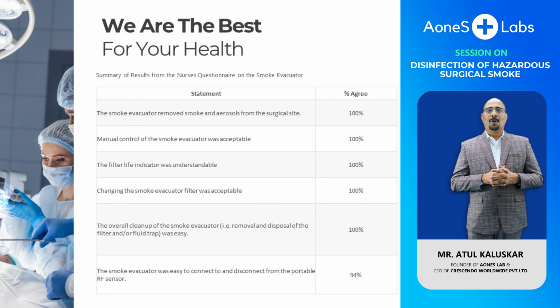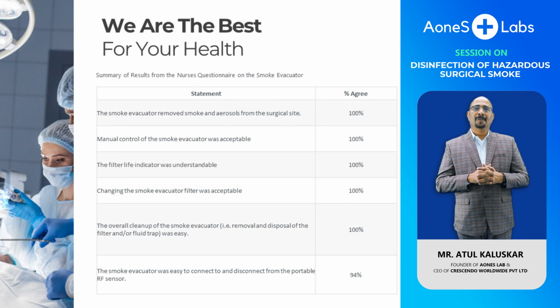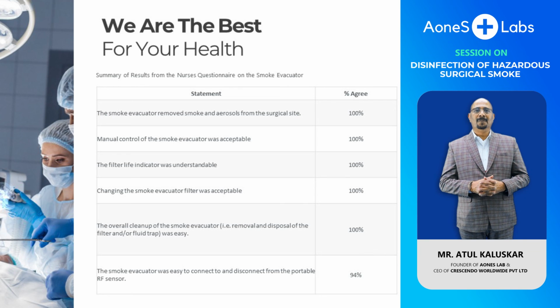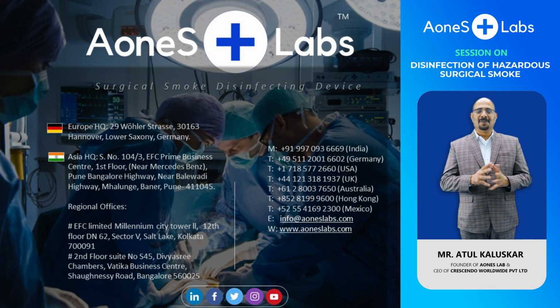So, coming to the problem of surgical smoke, India is not able to afford these manufacturers, especially in the times after Corona. I was working on this device pre-Corona, but especially during Corona, a lot of surgeons became really worried about surgical smoke. But Corona alone is not the important factor from the surgical smoke evacuation perspective, because smoke is dangerous not only to the surgeon himself but to the operation theatre team and even to the next patient.